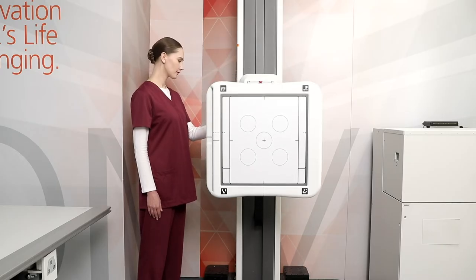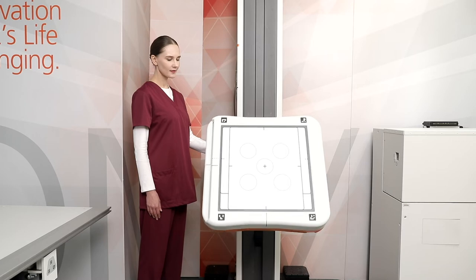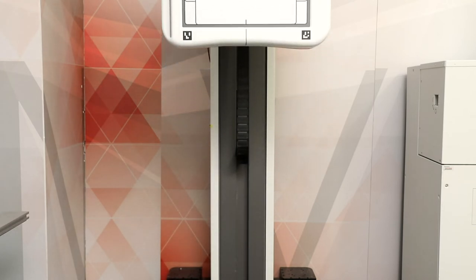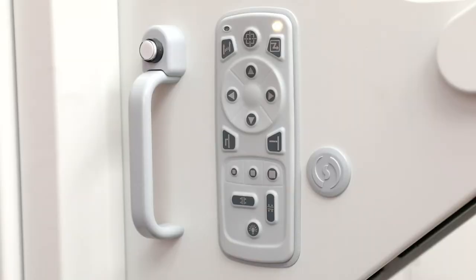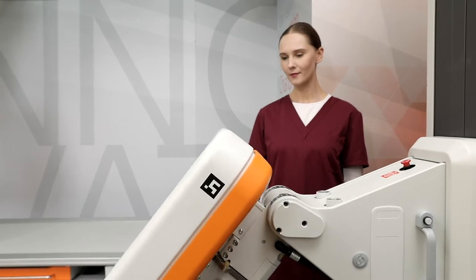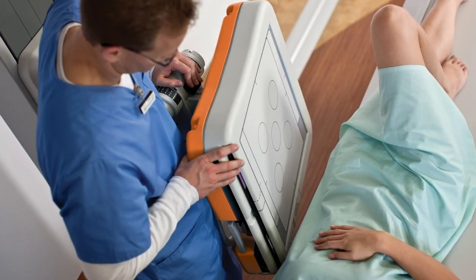Ergonomically designed with several options for movement, our wall stand is easy to use, simplifies patient positioning, and optimizes workflow. With a range of motion from the floor up to 180 centimeters, even the tallest patients can be accommodated. Tilt capability from negative 20 degrees to 90 degrees is available for extremity or under-table exams. Optional left or right swing up to 45 degrees allows easy access to cross-table exams on gurneys.